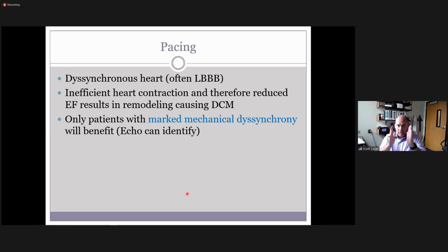So, you know, your E and A wave may get far apart. If there's AFib, you might not have an A wave at all. But sometimes your E and A wave gets so close together that it kind of fuses to be one. And sometimes you're cutting it off, where your timing might become too close to the next contraction and you're cutting off the actual flow. And so you have to time all those things so that they're most normal looking. And that's when your patient is asymptomatic and in an optimal position.